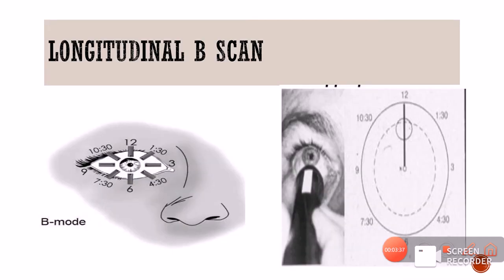The next type is the longitudinal B-scan. In the longitudinal scan, the probe is placed perpendicular to the limbus at every point, and the marker is always directed towards the cornea. Here is a patient where we are doing a longitudinal B-scan — the probe is not placed onto the cornea, so it is not axial. It is perpendicular to the limbus with the marker position superiorly, giving us a slice in the longitudinal fashion.